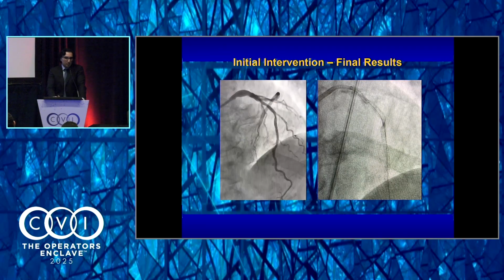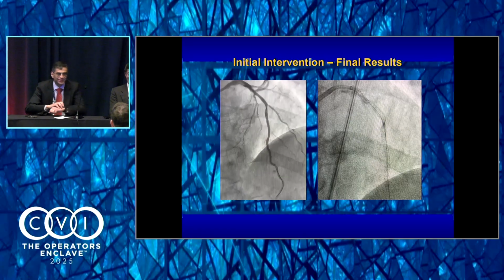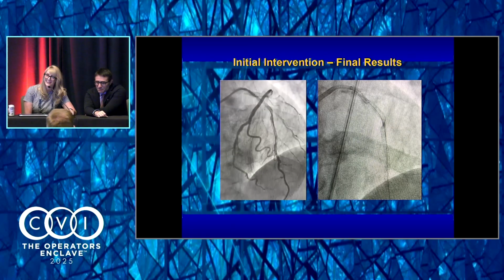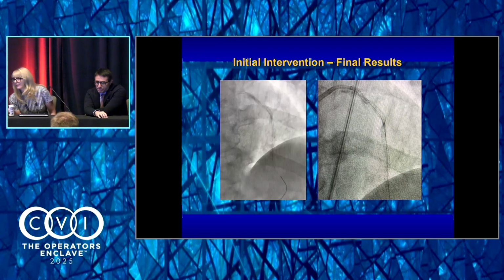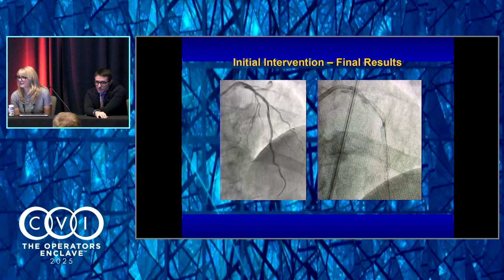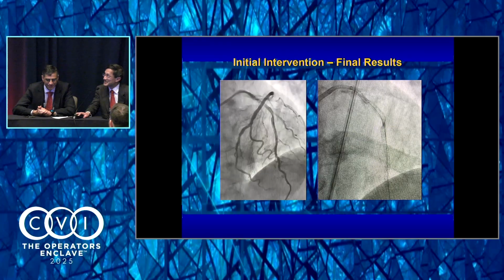And this... So we'll be putting 2.5 stents in the mid-LAD in a man? I was going to say, no, that doesn't exist. So it's very likely undersized. It's already a great case because you put in 3 layers into a calcified underexpanded lesion. So this will be a good test case.